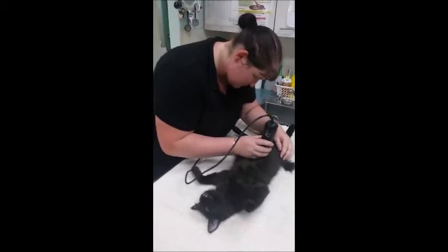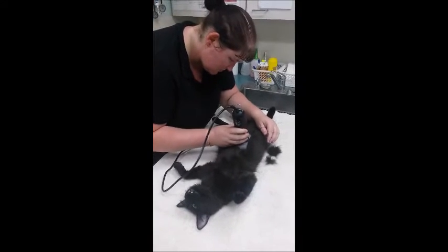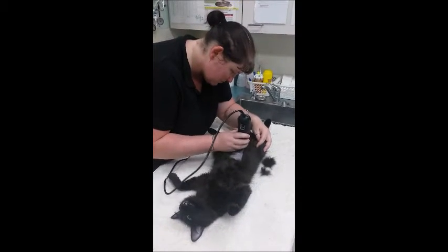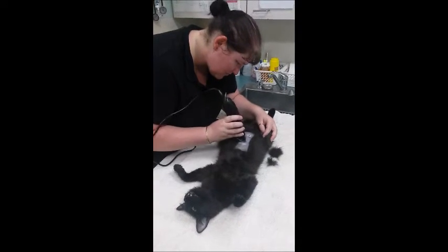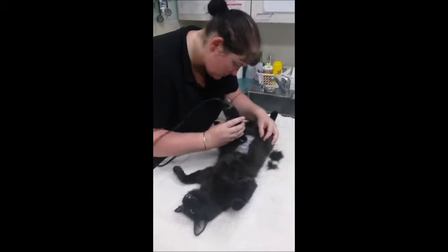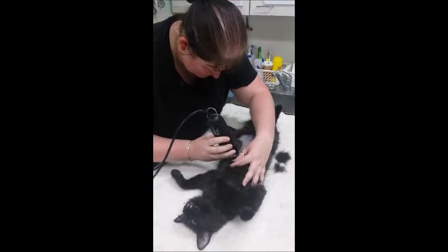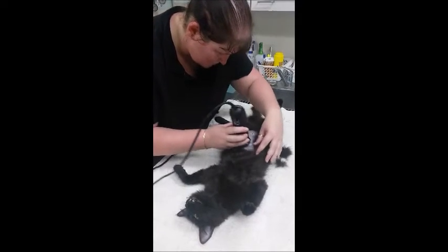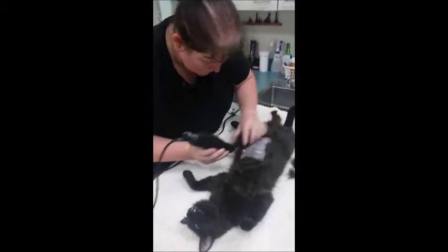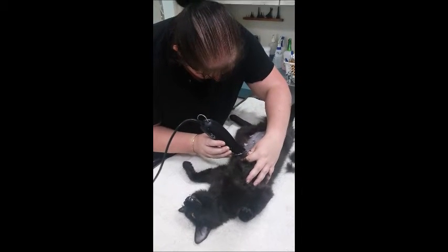I start by clipping the cat's abdomen using clippers designated for clean surgeries with a number 50 blade. I clip starting at the umbilical scar, going about two centimeters above and two centimeters either side of the nipple, working my way downwards. I always shave against the hair — it just makes for a cleaner clip and gets close to the skin.